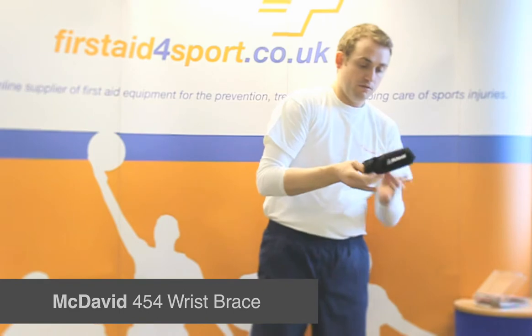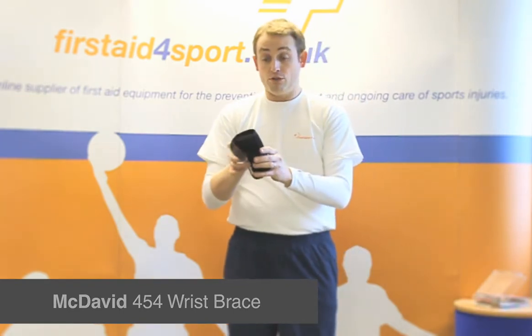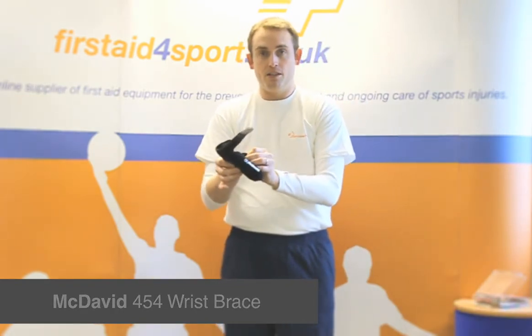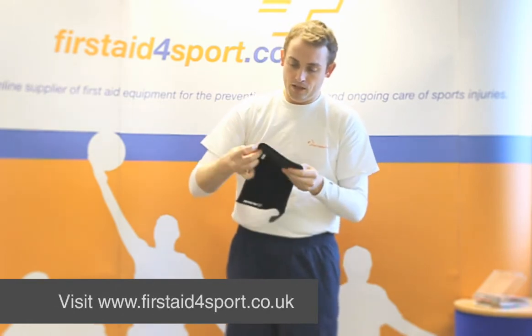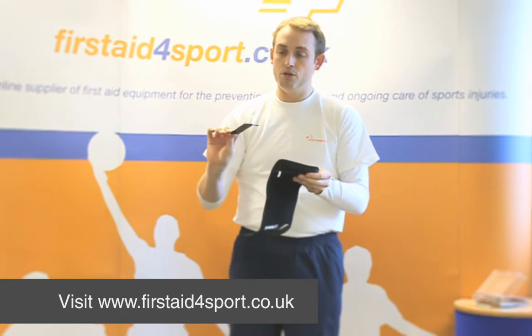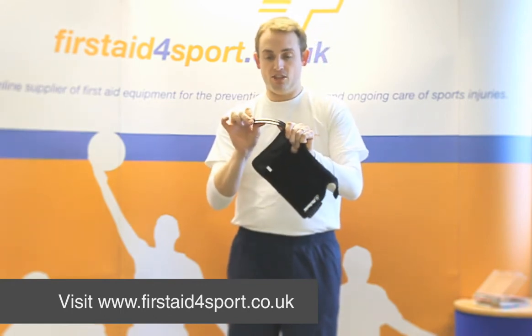This brace is for left and right hand. You have to buy this specific brace for you, and it's a wrap-around support with a removable plastic rigid stay.